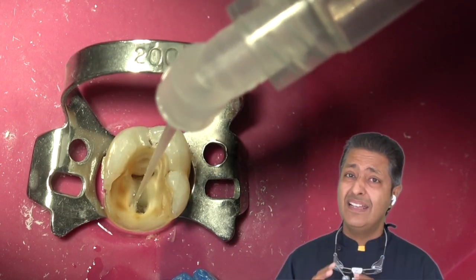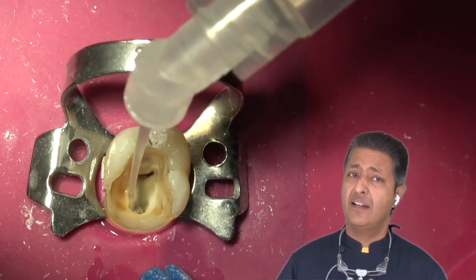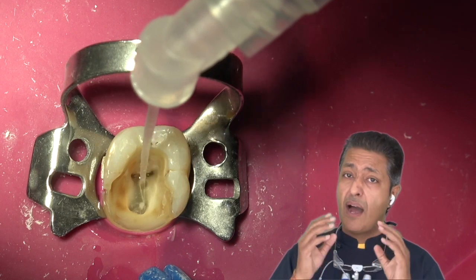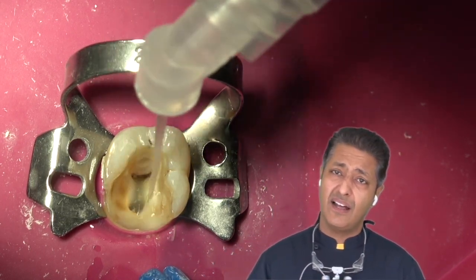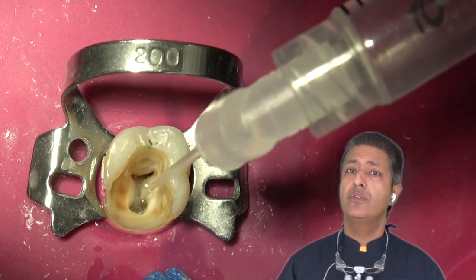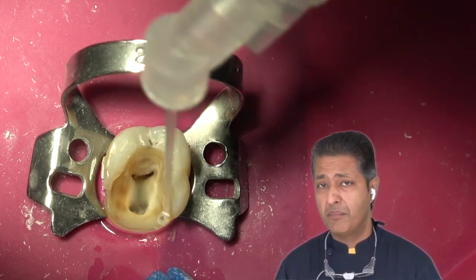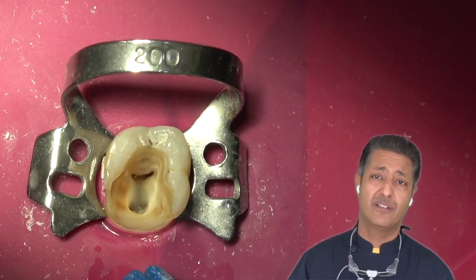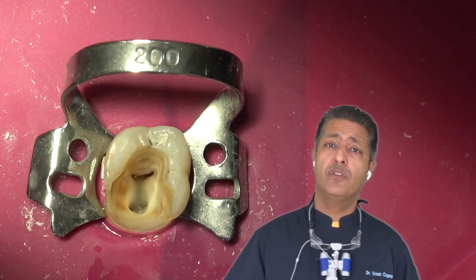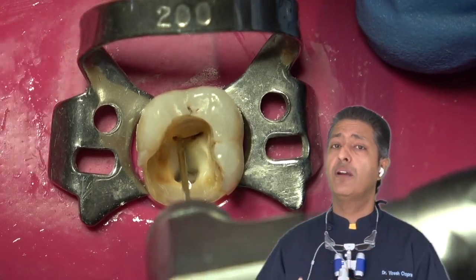So less irrigant extrusion happens in the periapical area, and we have enough evidence in the scientific literature. So after every instrument that is inserted inside the canal, please use irrigation. Do not ignore irrigation. Yes, I am repeating this because I feel that irrigation is one of the most ignored steps.